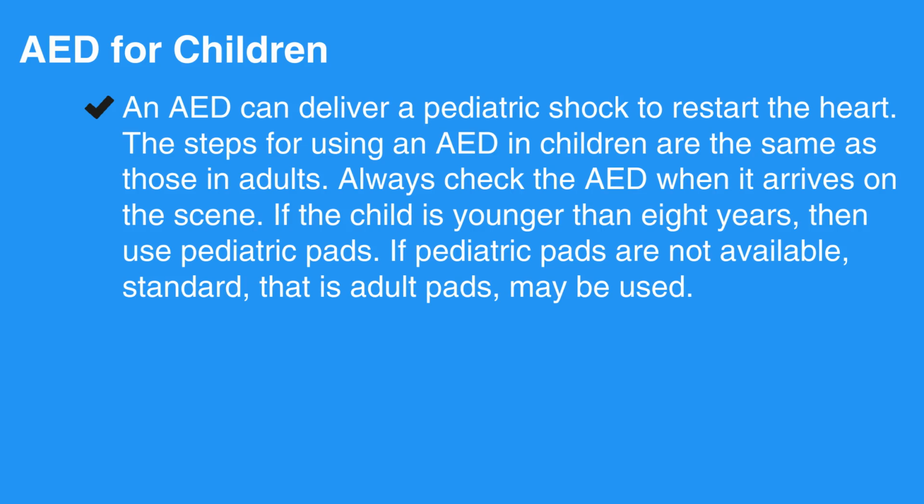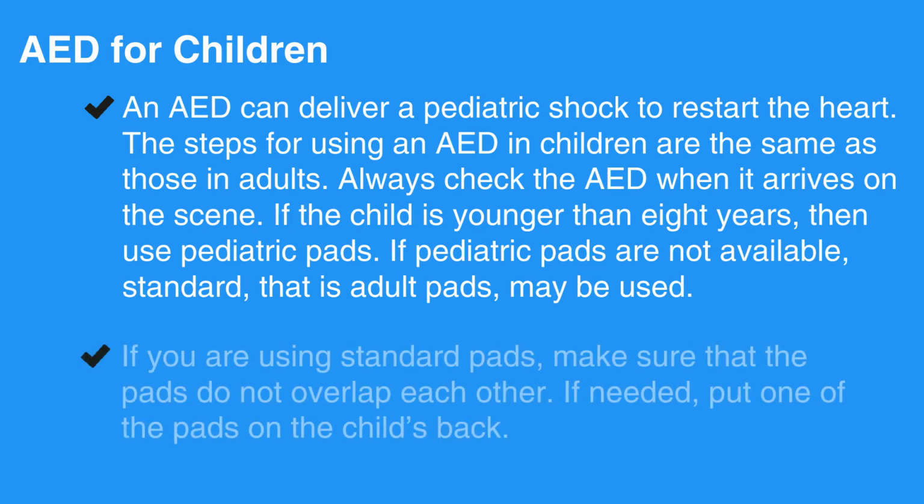Always check the AED when it arrives on the scene. If the child is younger than 8 years, then use pediatric pads. If pediatric pads are not available, standard, that is adult pads, may be used. If you are using standard pads, make sure that the pads do not overlap each other. If needed, put one of the pads on the child's back.